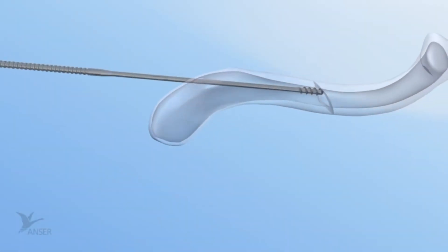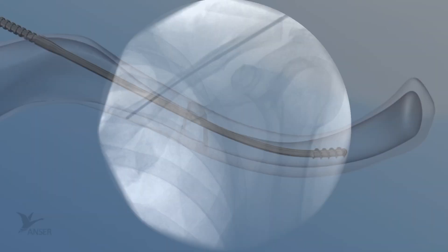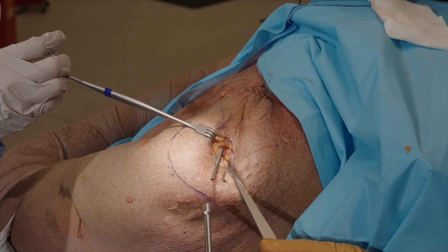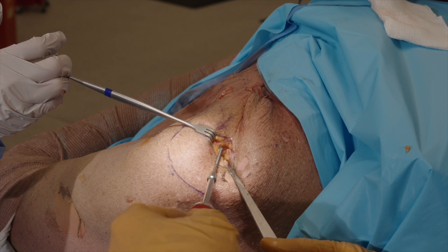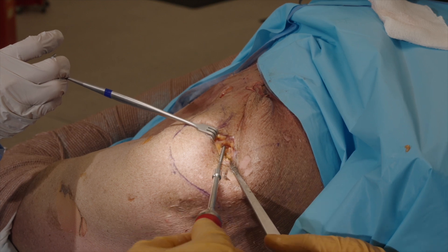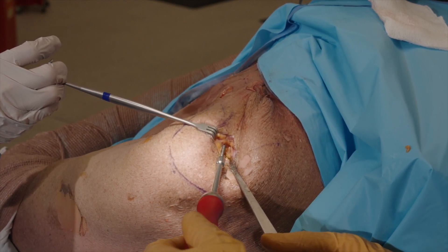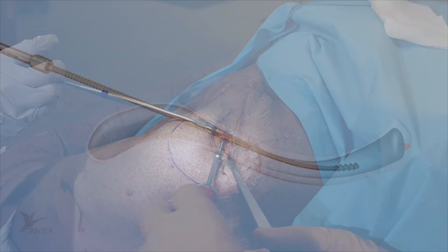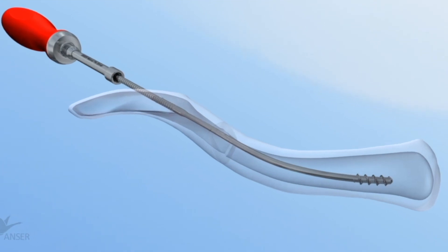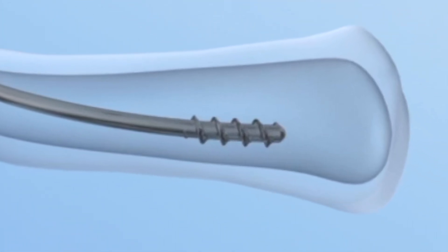Advance the Anser clavicle pin into the medial fracture fragment and verify the position by means of fluoroscopy. Once across the fracture site, switch to the Anser manual pin driver to have tactile feedback on the amount of purchase. Manually advance the Anser clavicle pin towards the SC joint. Optimal position is approximately one to two centimeters from the SC joint when adequate purchase is obtained. The medial fixation is now established. Note: the medial thread is designed to anchor itself against the anterior cortex of the medial fragment.